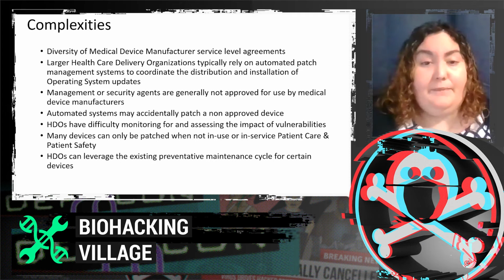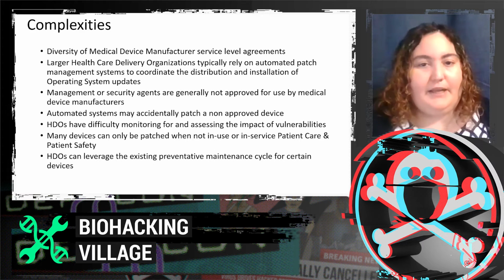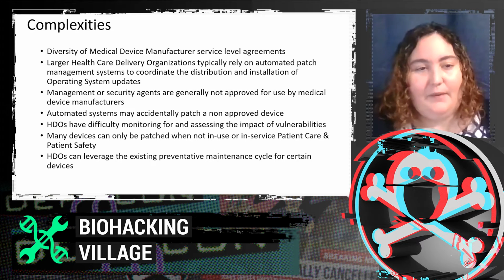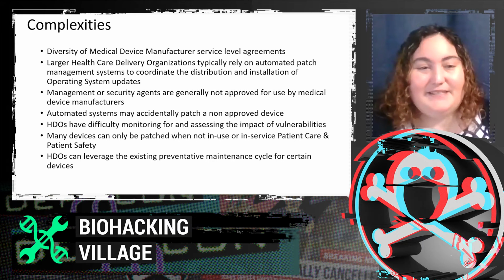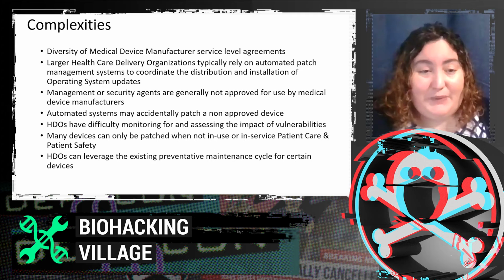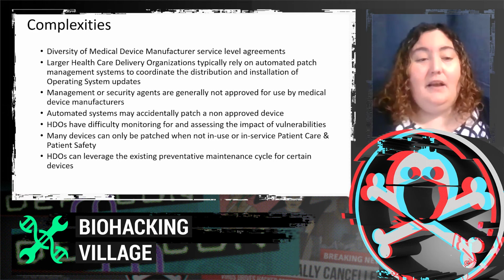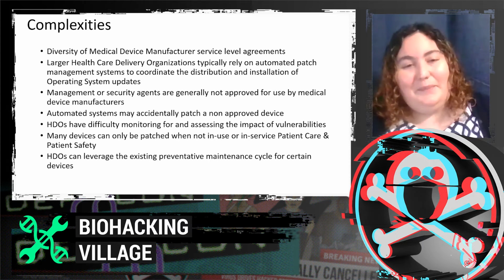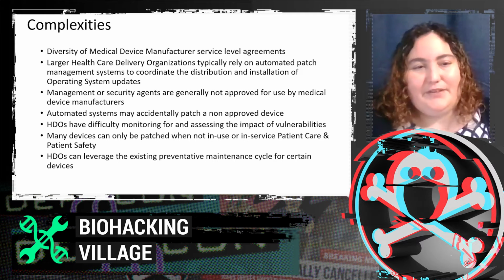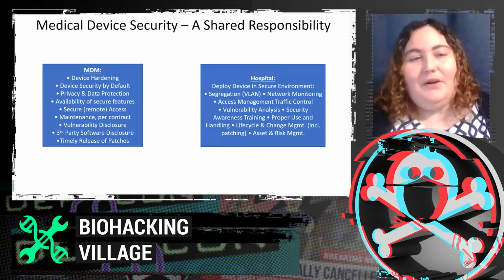HDOs have a difficulty monitoring for and assessing the impact of vulnerabilities. They may not know that vulnerability exists, so they don't have a lot of visibility into what the third-party components are of that product. Many devices can only be patched when not in use or in service for patient care and patient safety reasons. And for this, I'm saying leverage your existing preventative maintenance cycles for certain devices, but when the device is in use 24/7, that cycle might not come quickly enough. We hear this a lot.